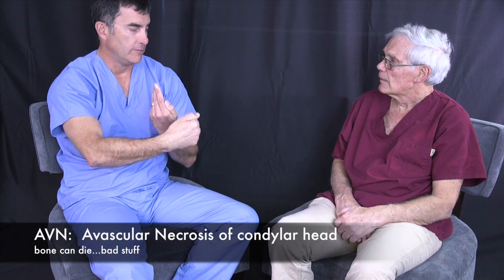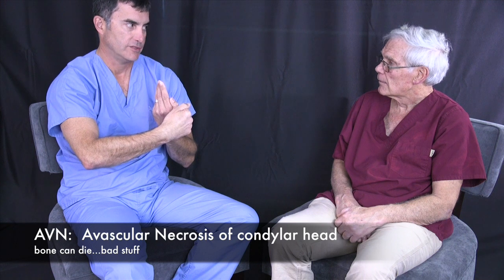Right. That's what I mean by, I don't care if they say it's reversible, it's not reversible. And you wouldn't do an equilibration to fully seated in that condition either. Hence the importance of imaging the backside. Yes. If you're ignorant to that, you shouldn't be doing this. Right. That's the whole point of all this. I don't care if it's DTR or equilibration or if you're restoring down and forwards, you need to know where your cartilage is.